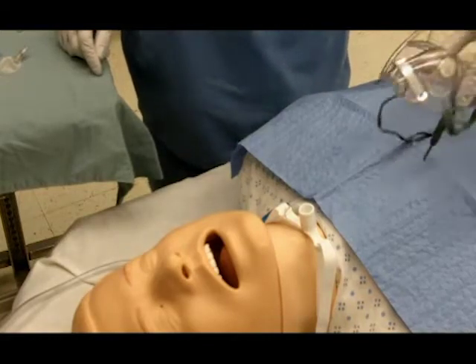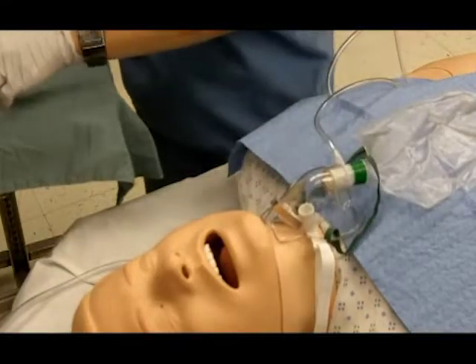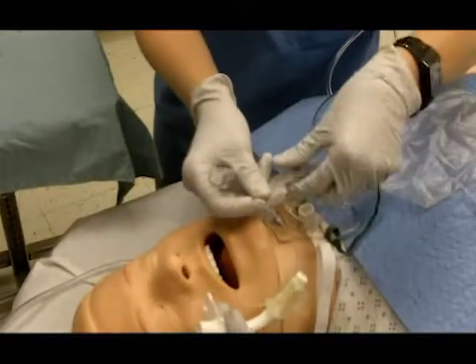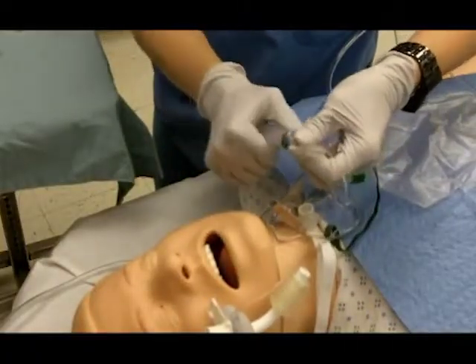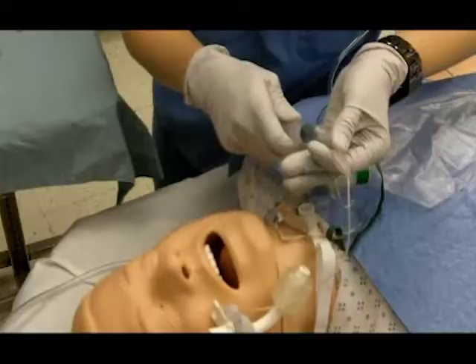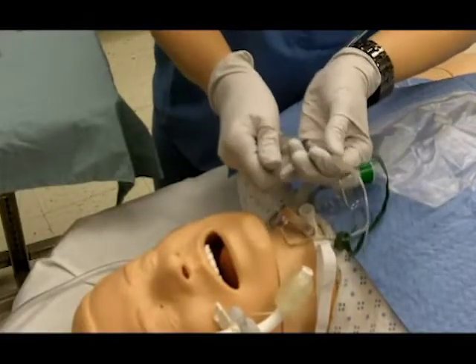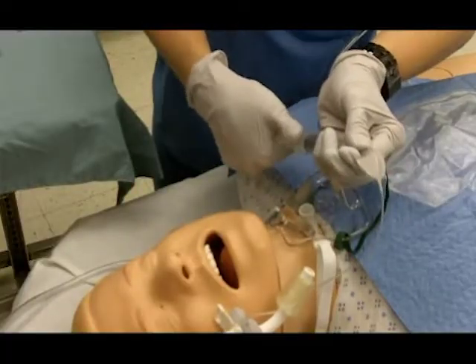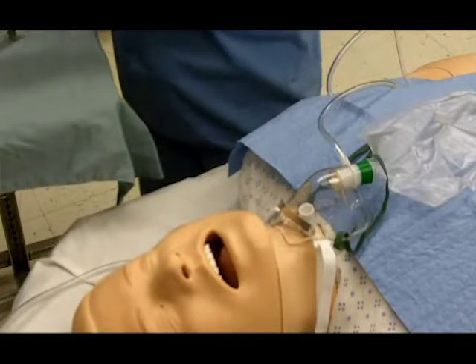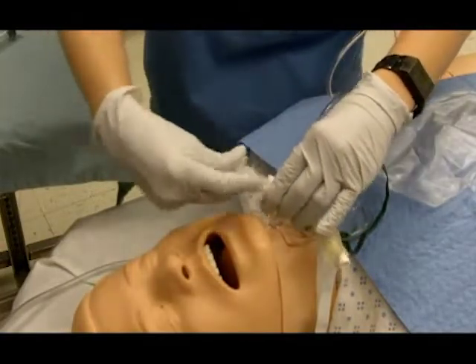Provide supplemental oxygen via the old tracheostomy tube prior to the change if time allows. Test the new cuff before for air leaks. Insert the obturator into the tube. Lubricate the tube with SurgiLube.